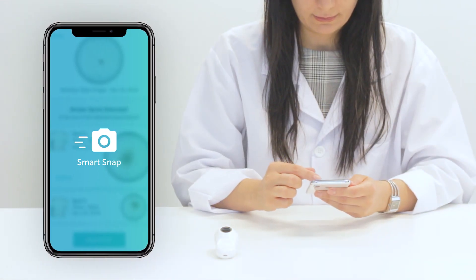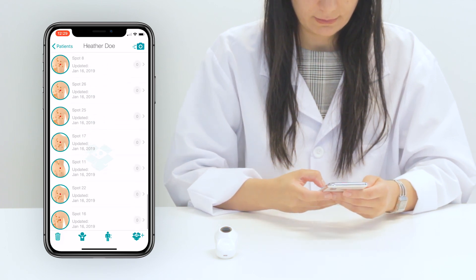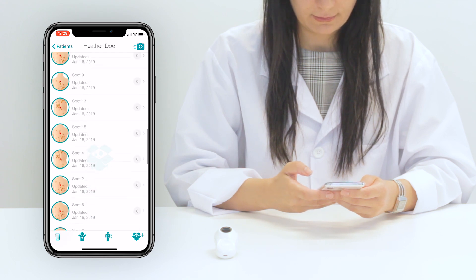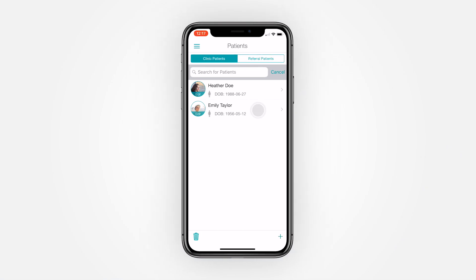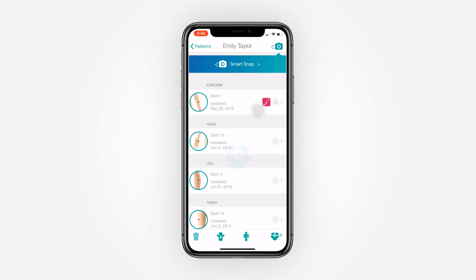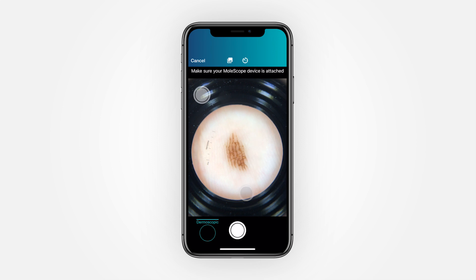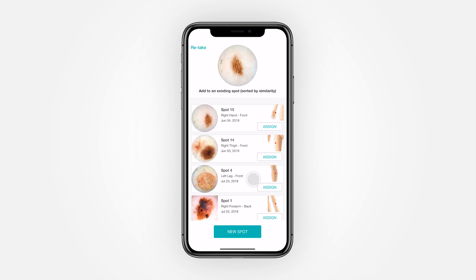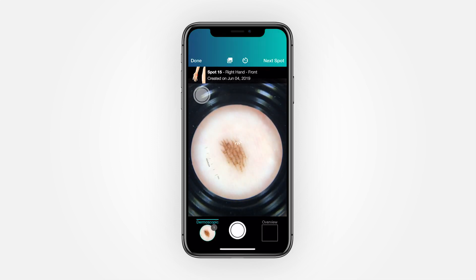For follow-up images, rather than wasting time trying to find a patient's spot, SmartSnap suggests the most similar images using DermEngine's AI, letting you locate it in a matter of seconds. To get started, select your patient and tap the SmartSnap camera icon in the top right corner. Like before, you'll take your new dermoscopic image, and SmartSnap will then recommend which spots look most similar. Simply tap Assign or create a new spot. Additionally, this intuitive tool lets you capture several images without changing screens.